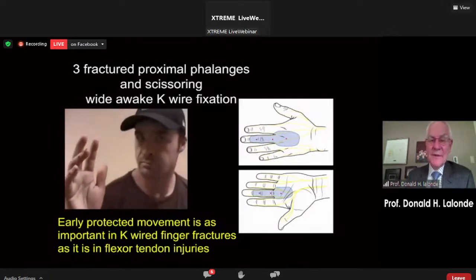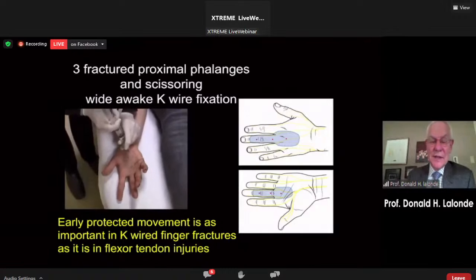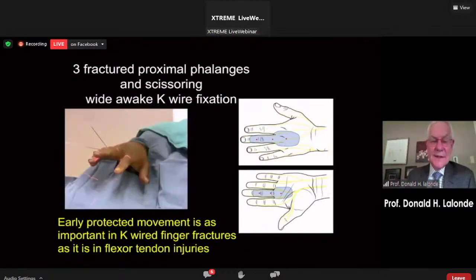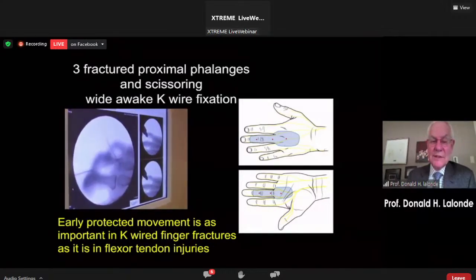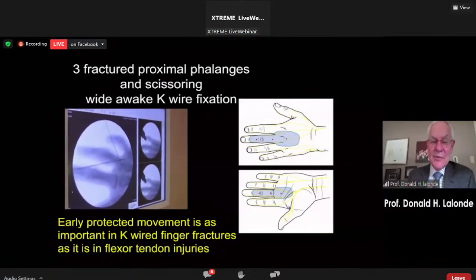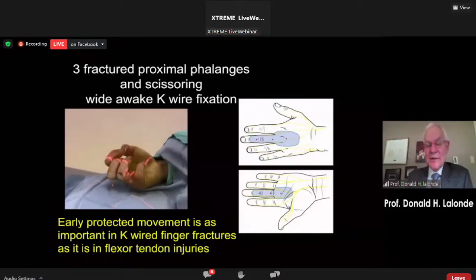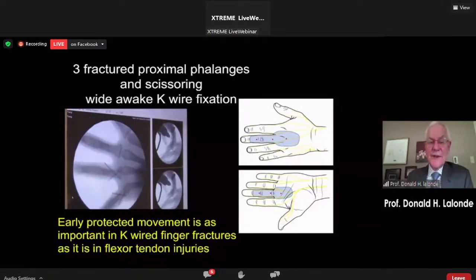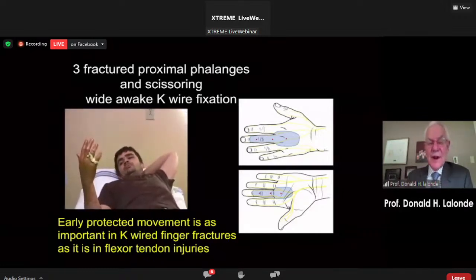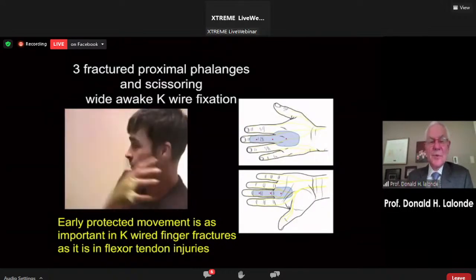So in this case, we had three fingers that were fractured. Two of them needed K-wires. So I put 10 or 20 cc's in the palm, and then we K-wired one finger and tested the stability. And then we K-wired the other finger and tested the stability. And just like flexor tendon repair, we do full fist flexion and extension testing. Because if they can do a full fist and it doesn't come apart on Friday, I know that on Monday I can do half a fist and it's not going to come apart, just like in flexor tendon repairs.